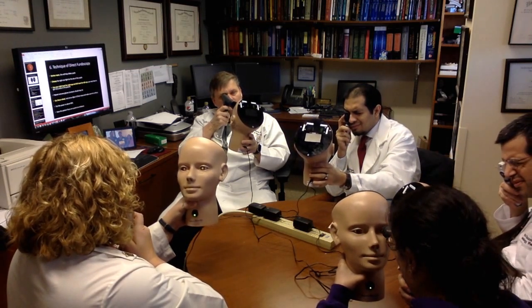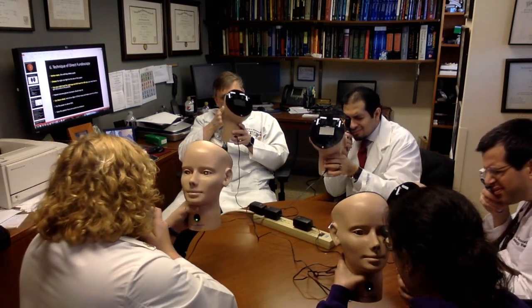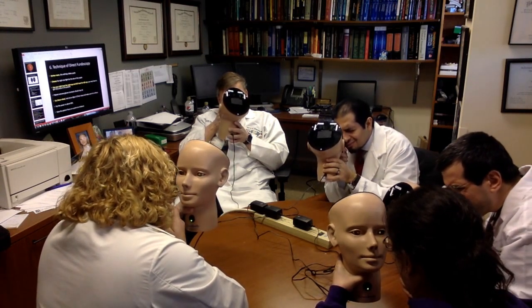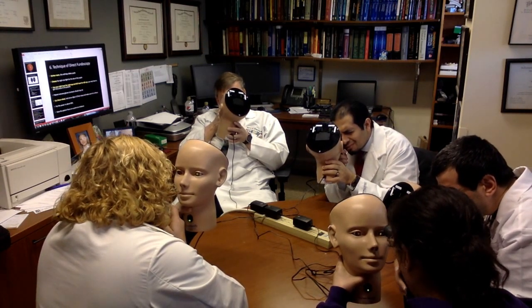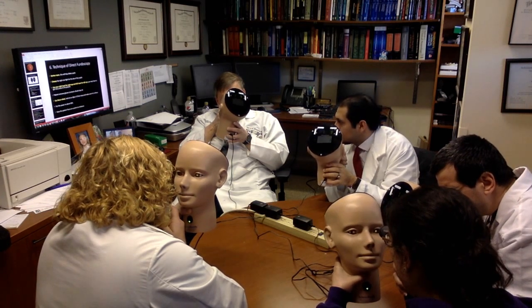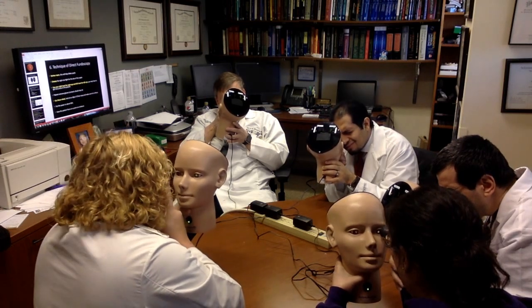That means you're getting the retina. And then what you do, you come in closer, closer, closer, go right up to the eye, and then you'll start to see the retina. And when you get there, you want to slowly turn your dial and make it as sharp as possible. Okay? So go ahead and do that.